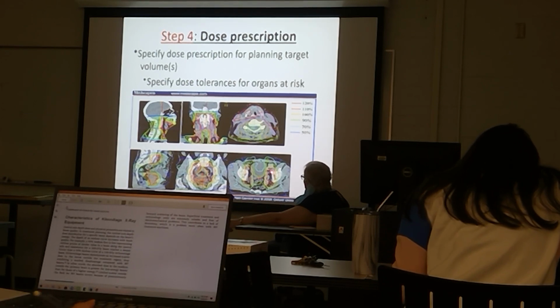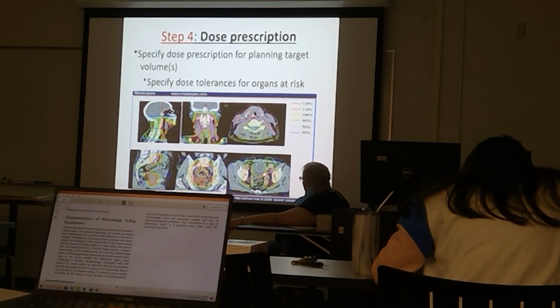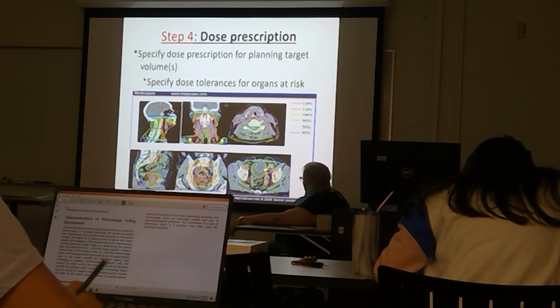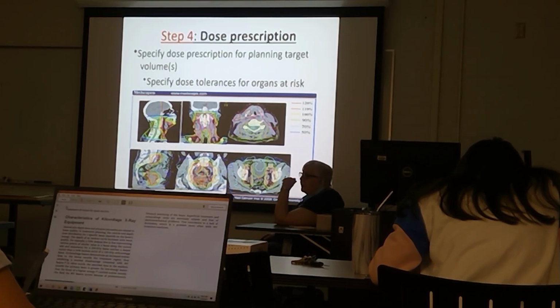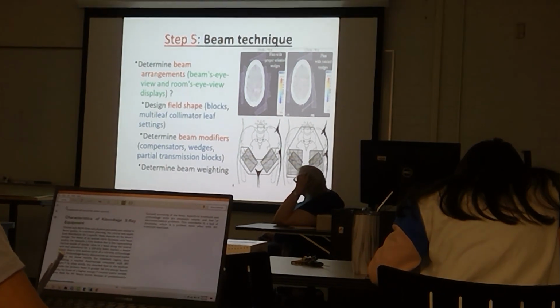This is much better. You see the little ones here and here, that would be acceptable. This little one here and here. This would probably not be acceptable. This might be, depending on what you're doing. We'll go into all that next semester when we're doing dosimetry, but I'm just giving you an idea here.